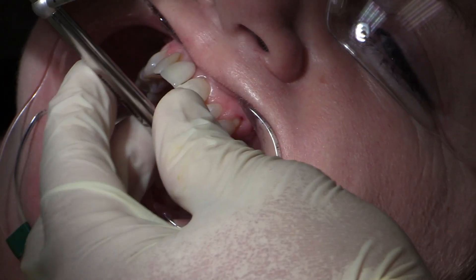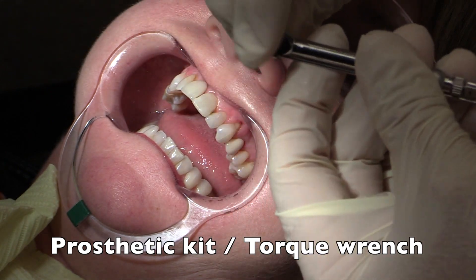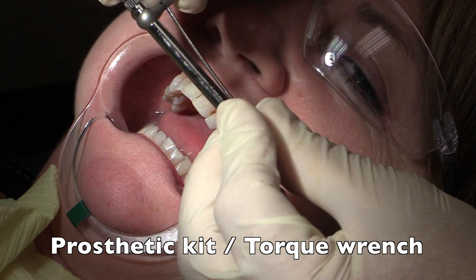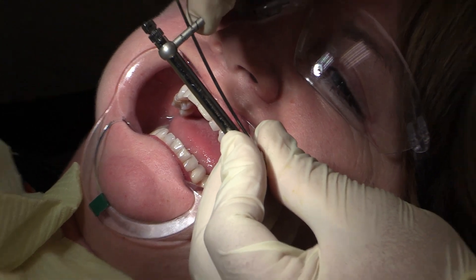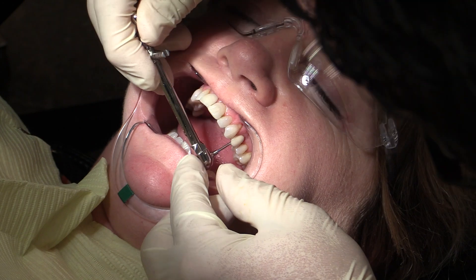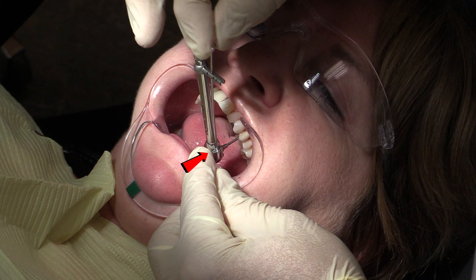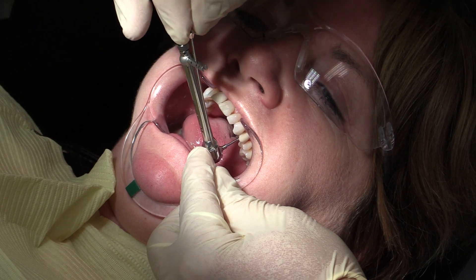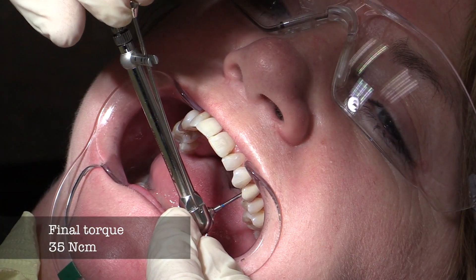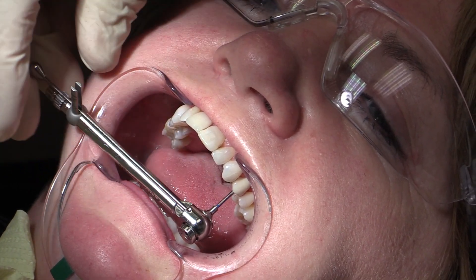We'll take the Nobel BioCare prosthetic kit and use the torque wrench, positioning it so that the back is showing 'Nobel BioCare' when we put in the driver. We have the OmniGrip screwdriver, snap it in, and use the prosthetic wrench to tighten it down. When tightening, we only want to touch in two particular spots: on the back right here, and secondly only on the teardrop. We tighten this down to 35 Newton centimeters — at 35, the screw is at final torque, locked down in the conical connection, providing the stability needed for long-term success.